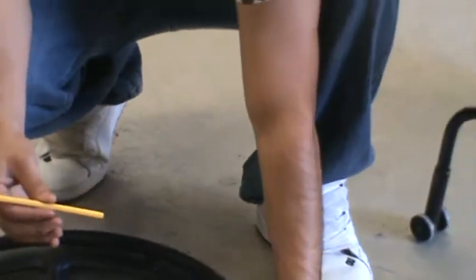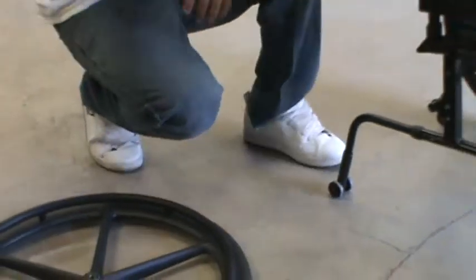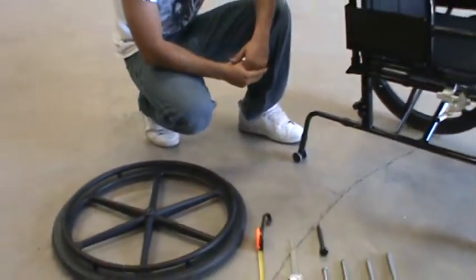So now we know that the axle length that this chair and wheel take will be 4.2 inches.